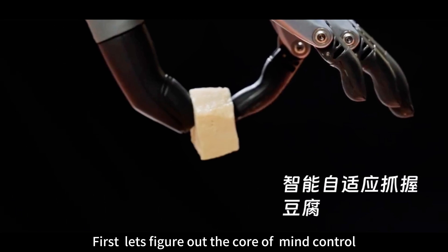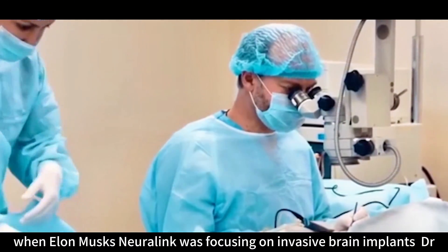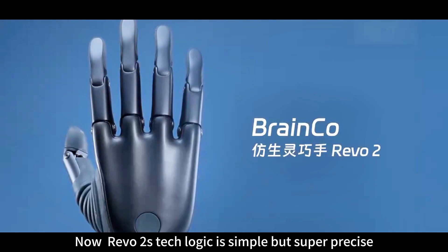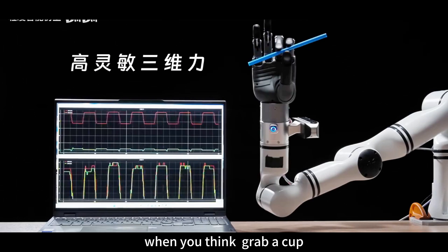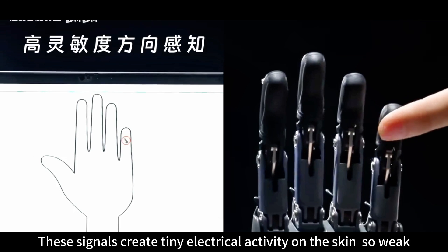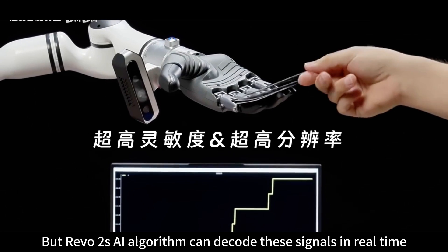Let's figure out the core of mind control. Back in 2015, when Elon Musk's Neuralink was focusing on invasive brain implants, Dr. Han Vixen from Harvard's Brain Science Center took a different path: non-invasive neural signal collection. Revo 2's tech logic is simple but super precise. When you think 'grab a cup,' your brain sends neural signals to the muscles in your arm. These signals create tiny electrical activity on the skin — so weak it's a million times weaker than an AA battery. But Revo 2's AI algorithm can decode these signals in real time.